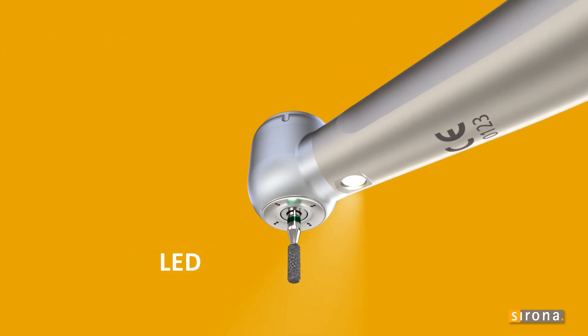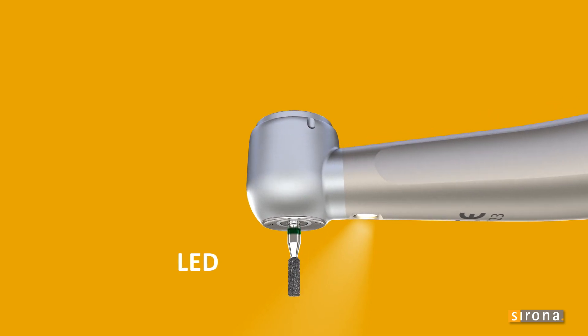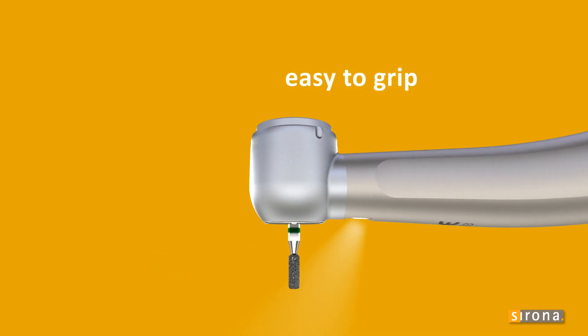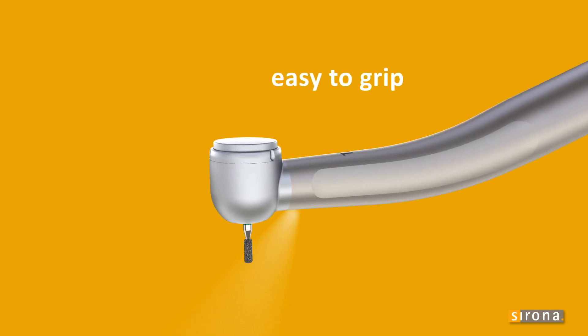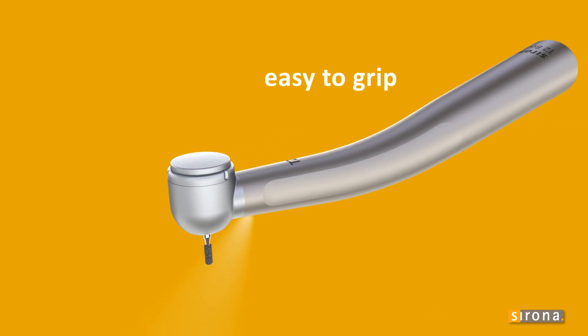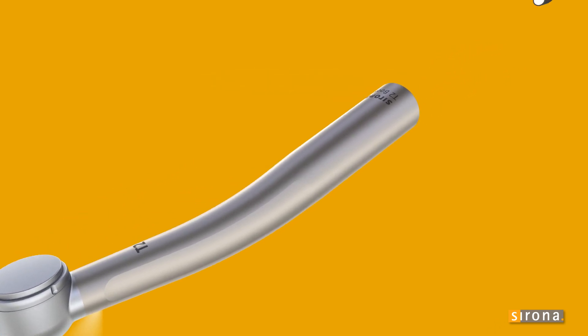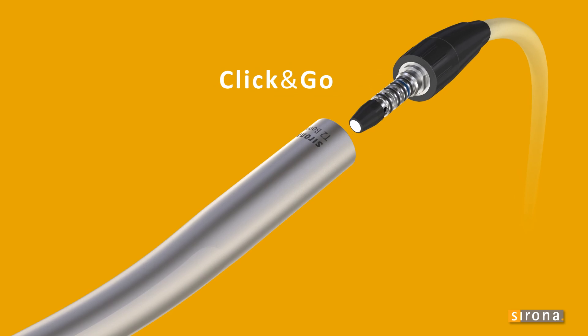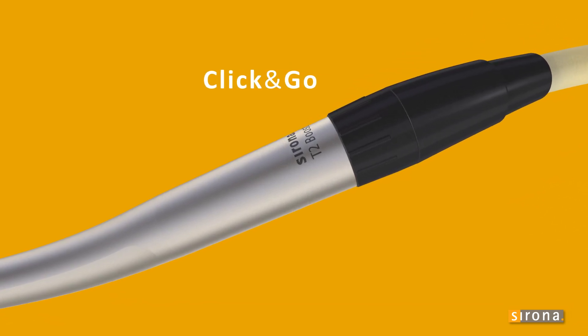Optimal illumination for great visibility during treatments. The smooth, seamless sleeve of the Sirona T2 turbine is comfortable and easy to grip for perfect operation. The turbines fit smoothly and securely in your hand. Thanks to the practical click-and-go interface, the T2 turbine allows quick and easy switching to all Sirona handpieces.